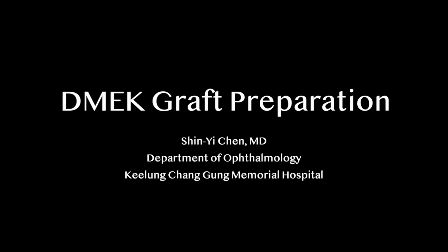Hello, this is the teaching video for my fellow, and I hope it can also help those who are interested in DMEK surgery.